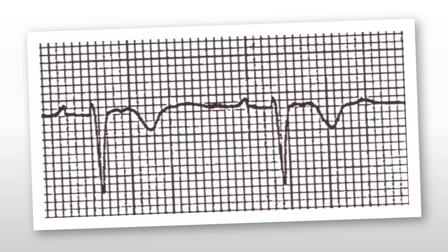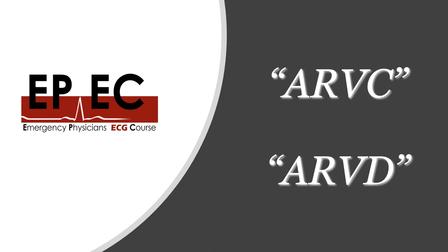Moving on, we also notice in V1 to V3 — especially in V2 — a weird-looking notch at the end of the QRS complex and the beginning of the ST segment. This is the second abnormality. Combining both abnormalities together leaves us with only one diagnosis: ARVC or ARVD — arrhythmogenic right ventricular cardiomyopathy, or arrhythmogenic right ventricular dysplasia.